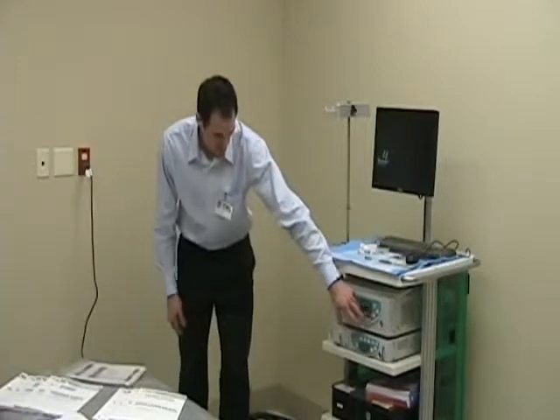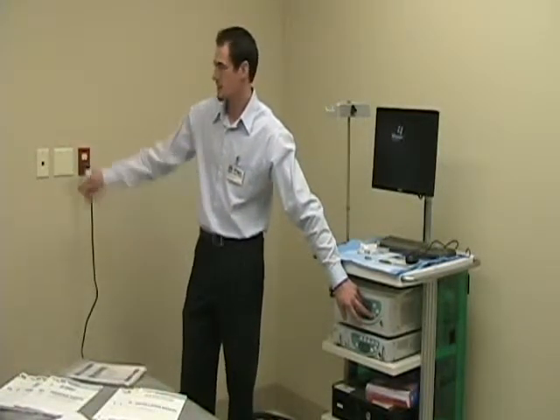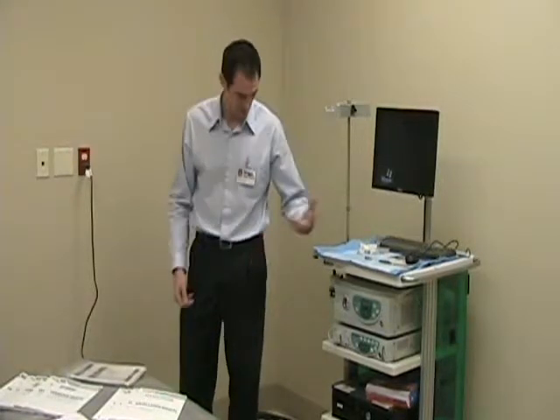There's the lamp. This is about the only button you'll ever touch. Just the lamp button. For every procedure, it's kind of like an on and off switch, which is nice compared to other equipment where you have to white balance. You'd have to turn the light on, white balance, and then do the procedure. Well, every time the lamp's on, it's burning hours. And how these lamps function is there's about 300 working hours on there. Of course, it's like a light. It doesn't go out at 300 hours. It could be less, could be more, but that's what they found could be the average. Anyway, every minute it's on, the clock's ticking.